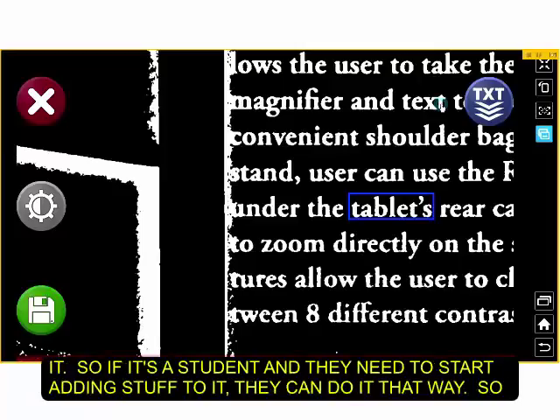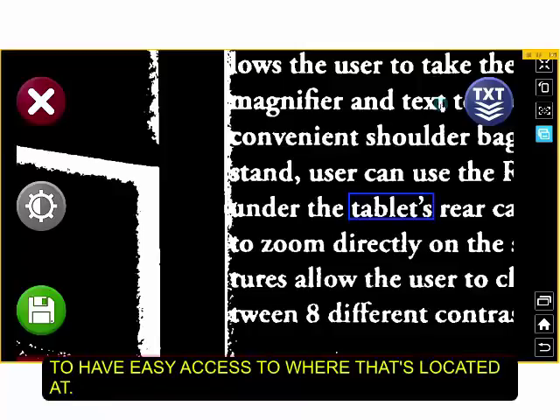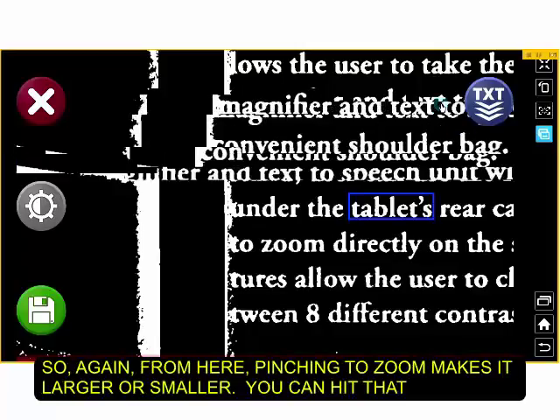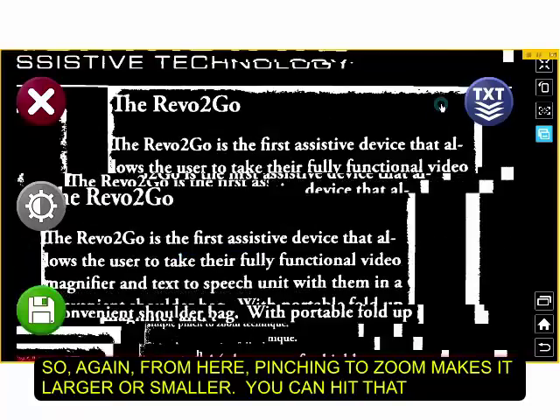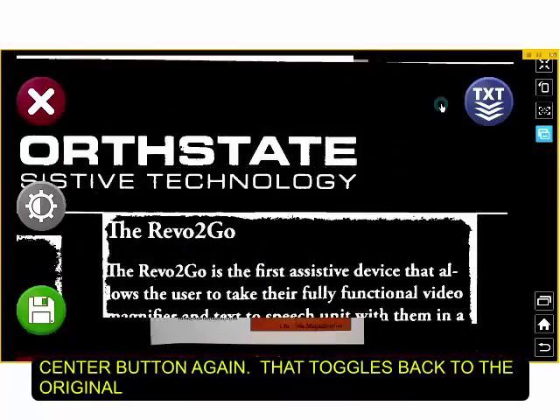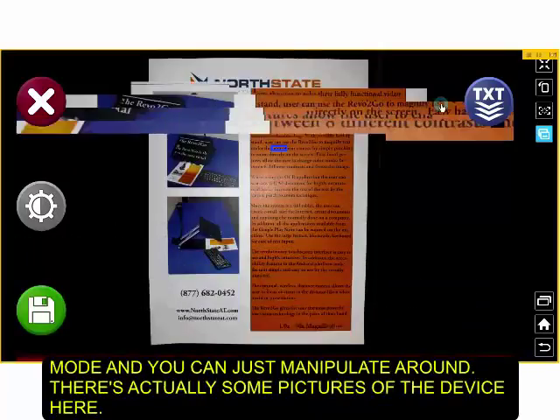So if it's a student and they need to start adding stuff to it, they can do it that way. And that's really where that's saved, in that file folder that's right next to the icon on the home screen, which allows you easy access to where that's located. So again, from here, pinching to zoom makes it larger or smaller. You can hit that center button again. That toggles back to the original mode.